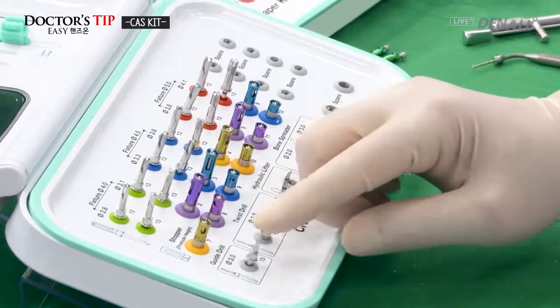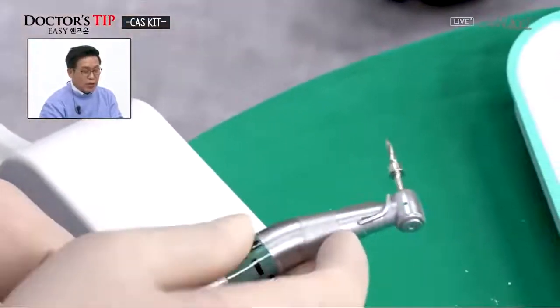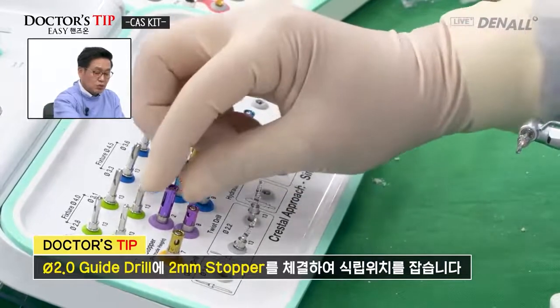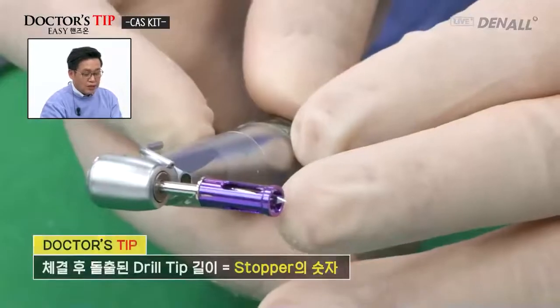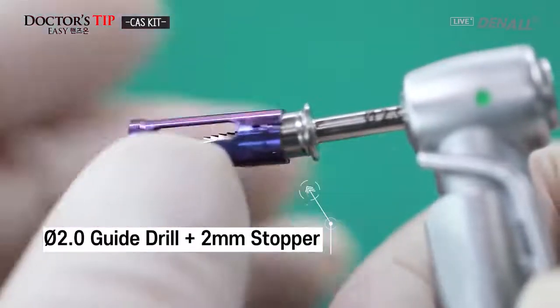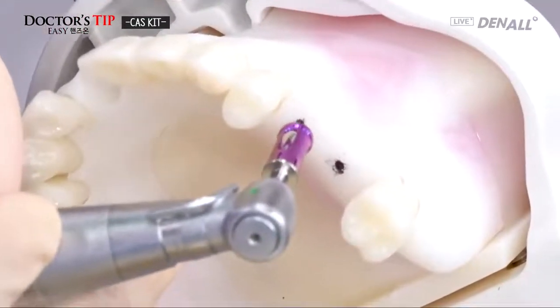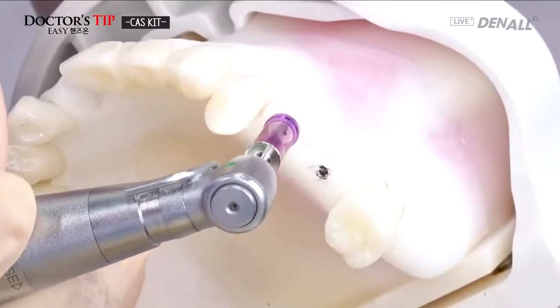The initial drill, guide drill 2.0, is chosen and is connected to the handpiece. For the guide drill, we need to check the location. A 2 millimeter stopper is connected to identify the placement location. Now it is connected. The guide drill tip is protruded a little bit. So it is marked black on the white model. At the 25 location, the marking is to be made.